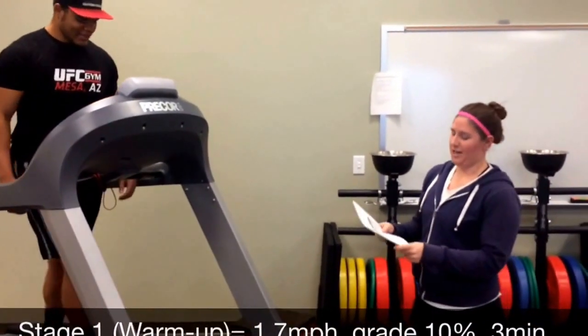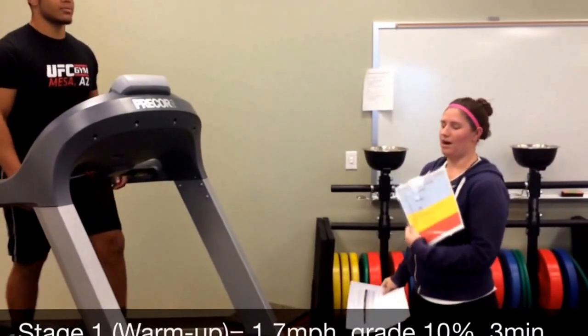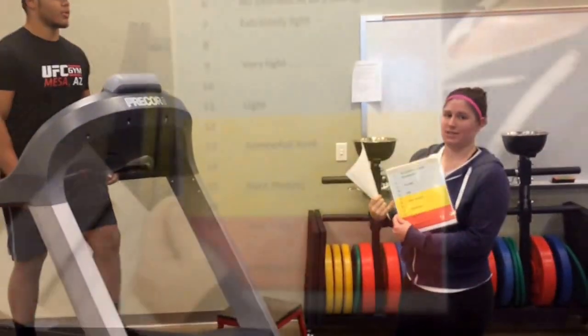At the end of each minute in each stage, we record heart rate and RPE using the RPE scale right here — it's rated perceived exertion.